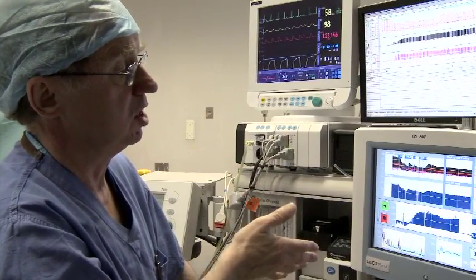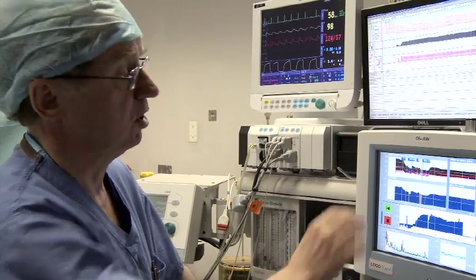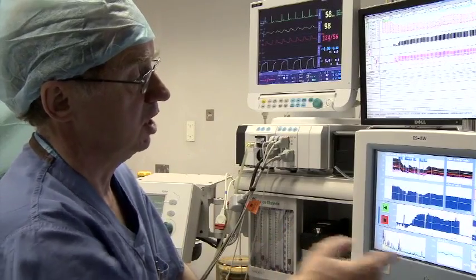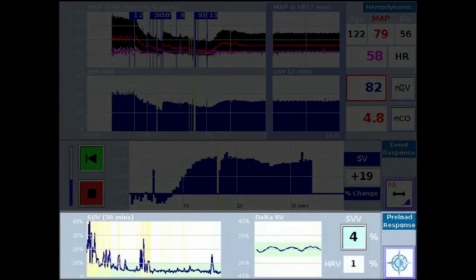We've also just learnt that this patient's haemoglobin has fallen further, down to 7.8 grams, and we will probably have to give him some blood shortly. At the moment, everything is maintained within the normal range, and stroke volume variation is only 3%. There is no need to give this patient any saline-based fluid or colloid. The only fluid he's getting is about 100ml an hour of glucosaline to maintain water and glucose balance, as he is a non-insulin dependent diabetic. This allows us to switch the fluid off, which many anaesthetists are reluctant to do — some will run a litre an hour irrespective. We know this patient is not short of fluid, so we just give basic maintenance, meaning when he wakes up he shouldn't run into problems such as pulmonary oedema.